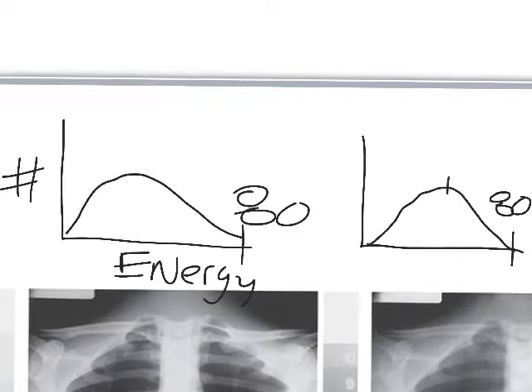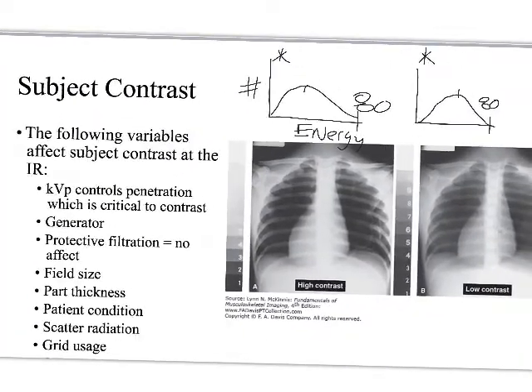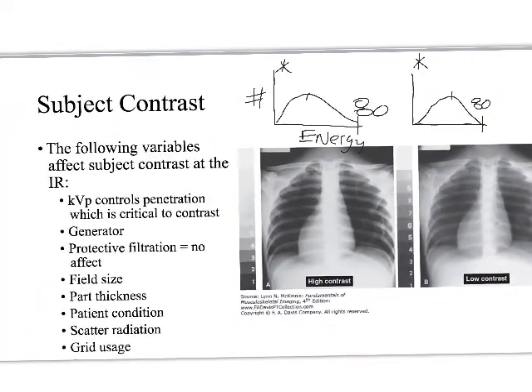So if the peak was here versus the peak was there, the peak is roughly a third of 80 kVp on this one, and this one's about half of 80 kVp, right? So the same thing kind of happens as we increase generator. The average KVP, the average energy increased. So there's a subtle difference in those curves, marking that the average energy has increased.